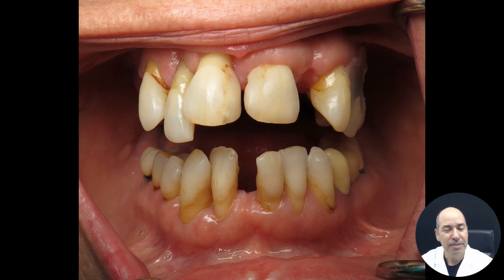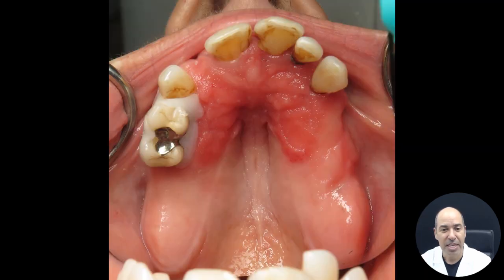This patient is going to undergo a very standard procedure, but she's not standard whatsoever. She allows me to show her face, which is just phenomenal because you're going to learn a lot from it. She has gum disease, periodontal disease, and there's a lot of photos here. And you can see how red the palate is. She was wearing one of those embarrassing removable things, and the teeth are loose. I believe she used to be a smoker and has stopped at this point. But she's ready for a new life.